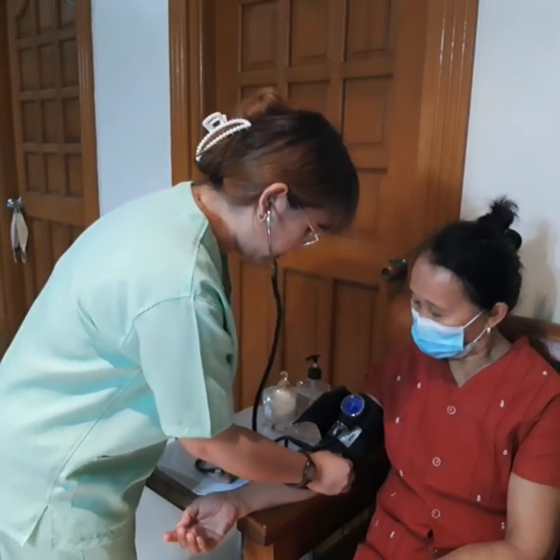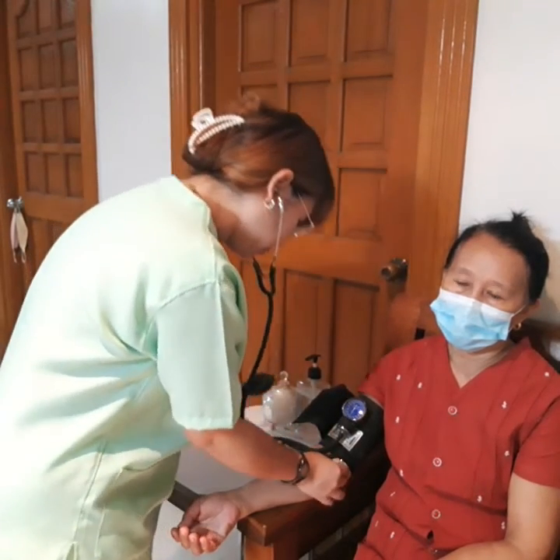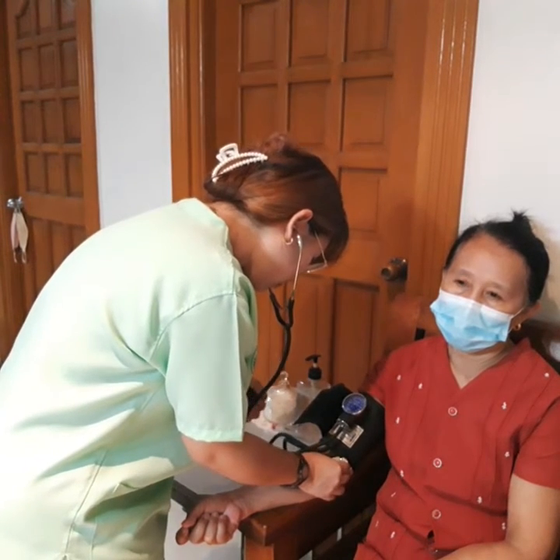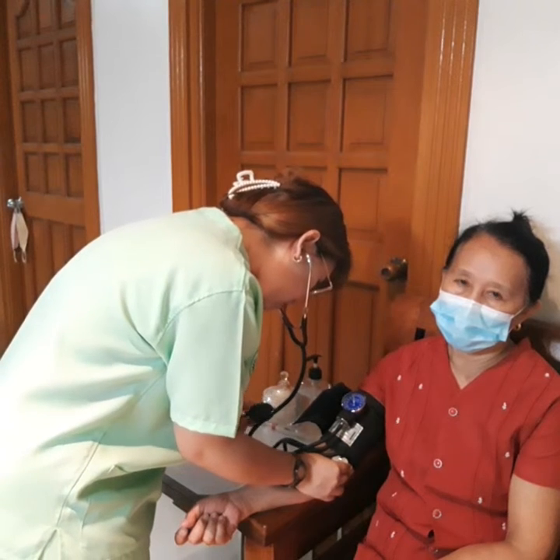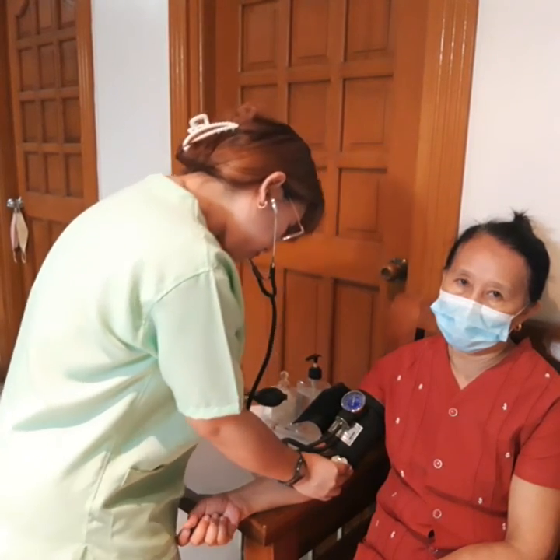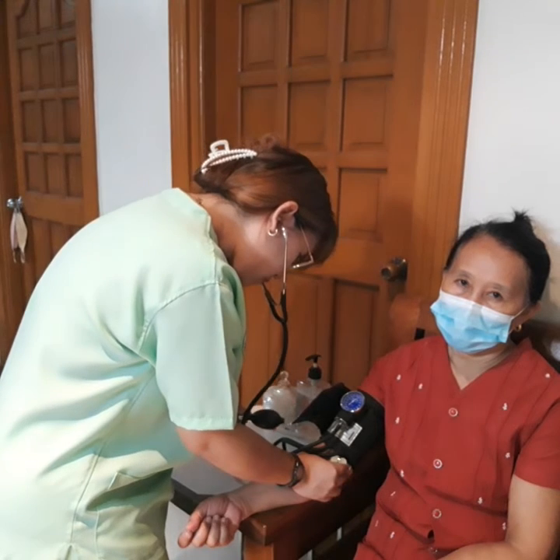Hold the pressure gauge in your left hand and the bulb in your right. Close the airflow valve on the bulb by turning the screw clockwise. Inflate the cuff by squeezing the bulb with your right hand. You may hear the pulse in the stethoscope. Watch the gauge and keep inflating the cuff until the gauge reads about 30 points mmHg above your expected systolic pressure. At this point, you should not hear the pulse in the stethoscope.